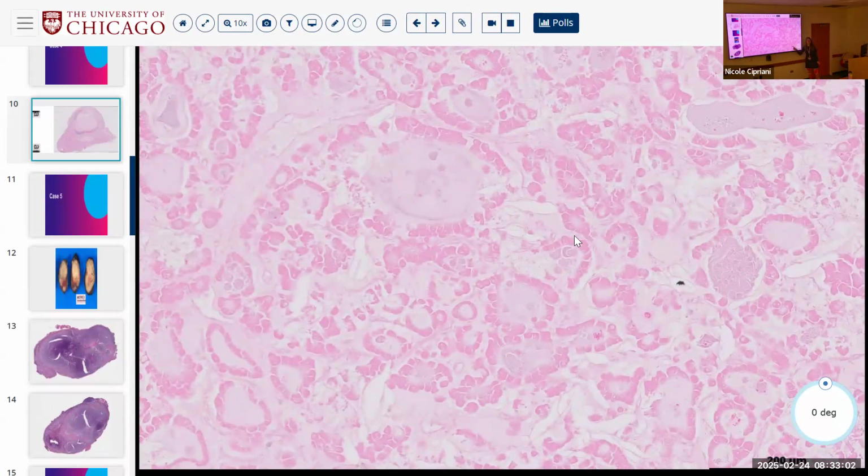So this is a huge pitfall or problem, specifically in oncocytic adenomatous nodules. They are highly sensitive to FNA. And so there have been patient reports of a week or a few days after FNA, they experience severe pain in their neck. And sometimes they end up getting resected and it's dead. It's completely infarcted. And so this is specific to oncocytic morphology. I don't know why. They must be somehow very sensitive to focal damage, and then they release some kind of cytokine and the whole nodule dies.